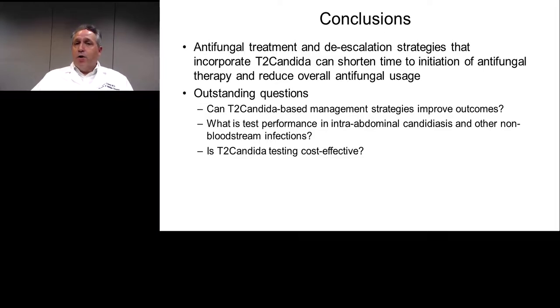There are questions that will be answered about what the performance is in deep tissue candidiasis and other non-bloodstream forms of disease, such as intra-abdominal candidiasis, and there'll be ongoing economic analyses to understand the cost effectiveness, as was suggested in the recent JAC study.